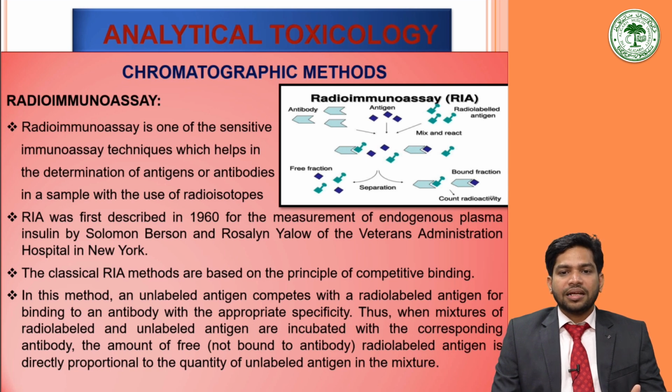In this method, an unlabeled antigen competes with a radio-labeled antigen for binding to an antibody with the appropriate specificity. Thus, when a mixture of radio-labeled and unlabeled antigens is incubated with the corresponding antibody, the amount of free radio-labeled antigen is directly proportional to the quantity of unlabeled antigen in the mixture. In this way, we can do the quantification of drugs as well.